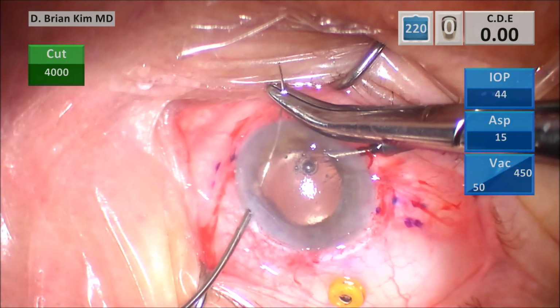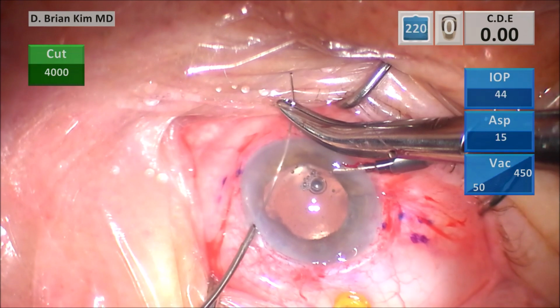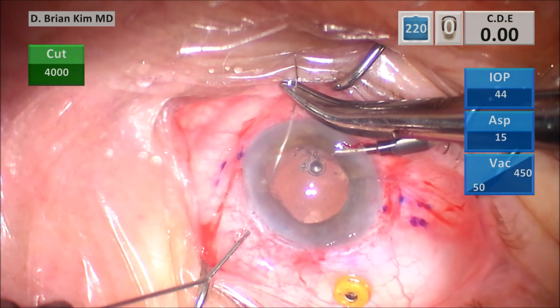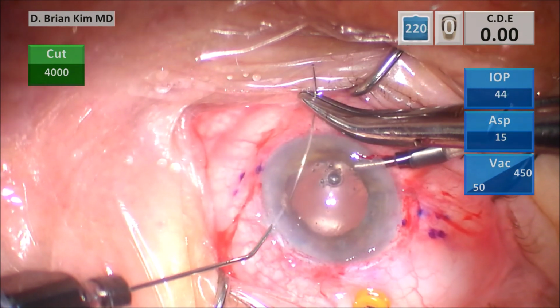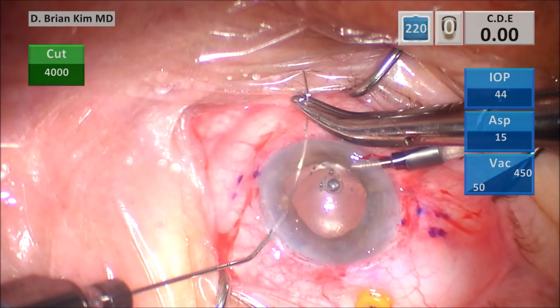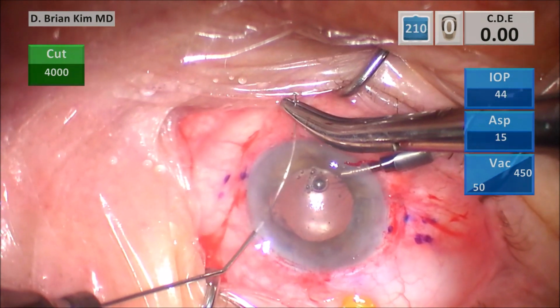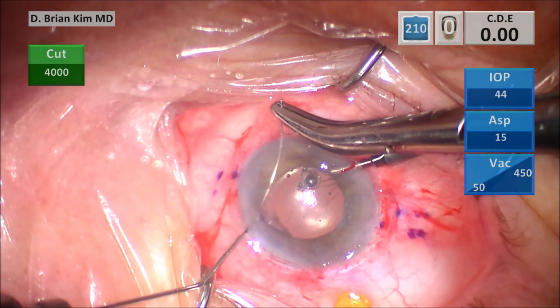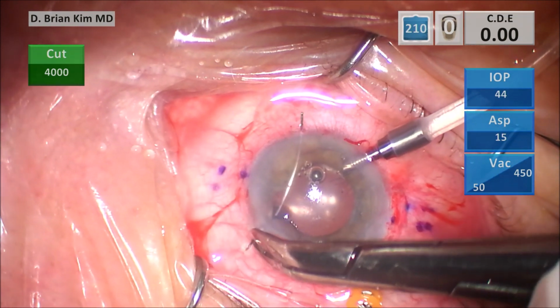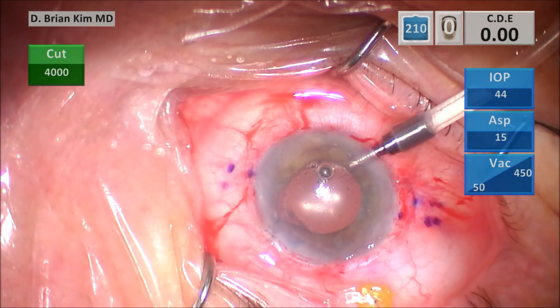So I made another incision and I'm using a cannula to help dock that needle on. Here it is. I had forceps and I switched to the cannula. And what's nice is you can basically push the needle into that cannula, which helps to externalize the needle without incorporating any corneal fibers in that needle pass, and then you're able to pull it out here.